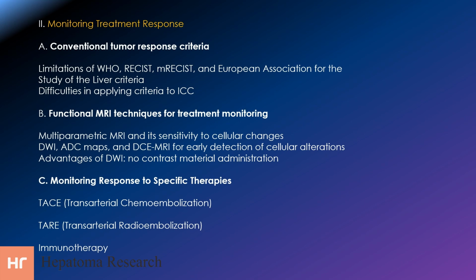In monitoring the response to transarterial chemoembolization, volumetric changes in ADC and contrast enhancement on MRI have been associated with favorable response to therapy and improved survival. Baseline ADC values and certain characteristics observed in baseline MRI scans, such as viable tumor volume and necrosis, can serve as predictors of survival rate in ICC patients undergoing TACE.